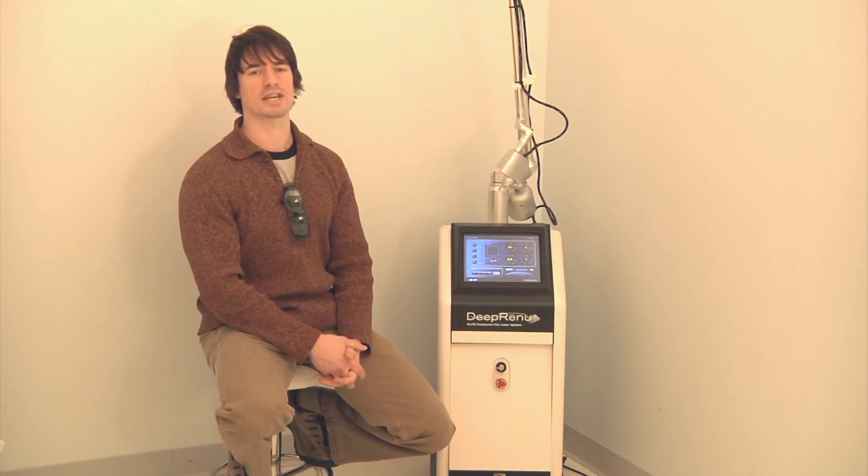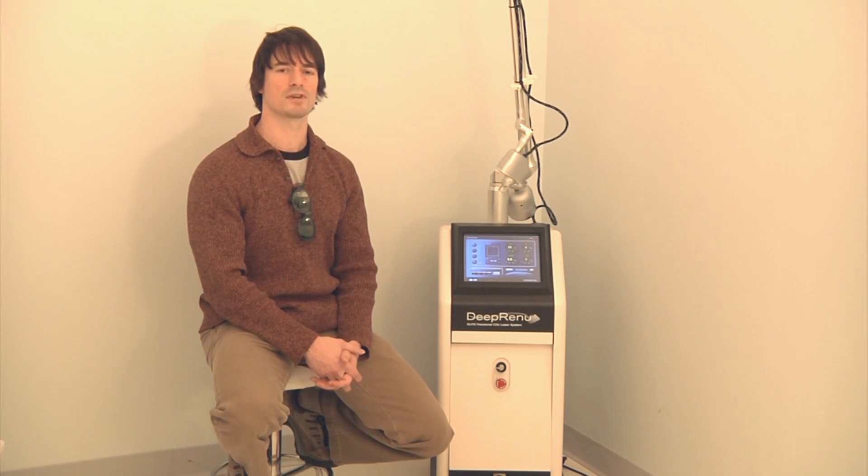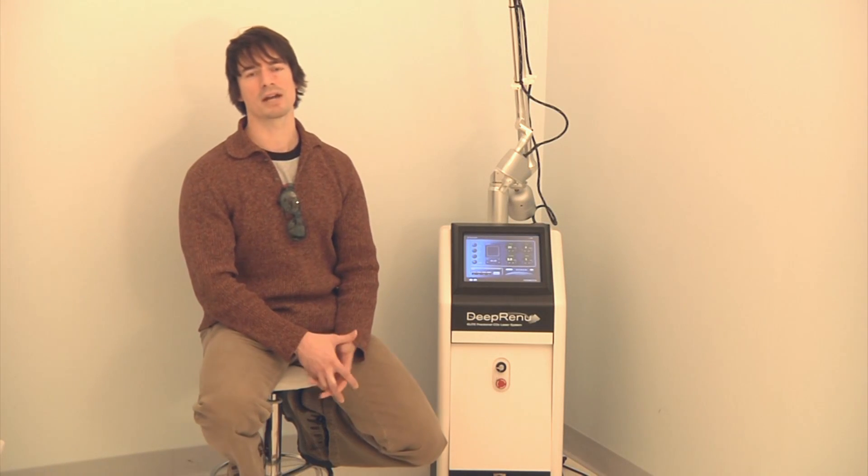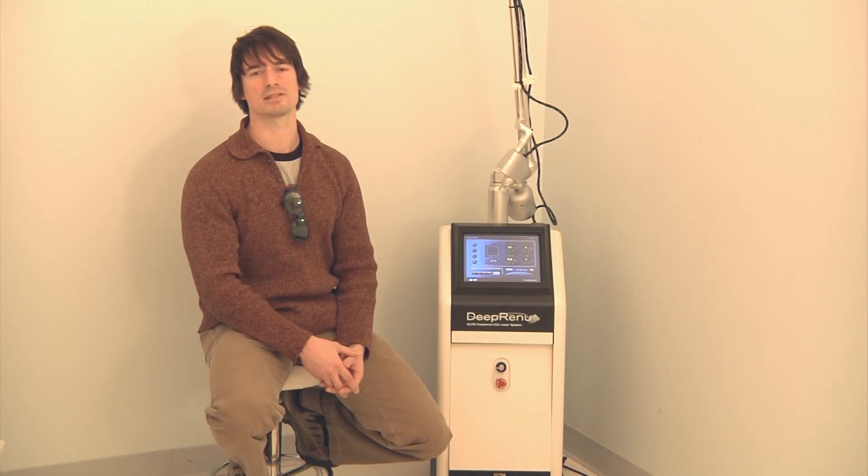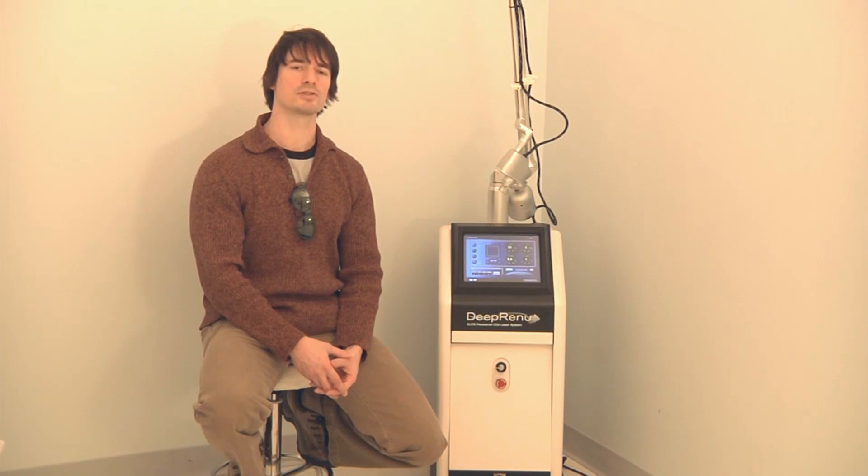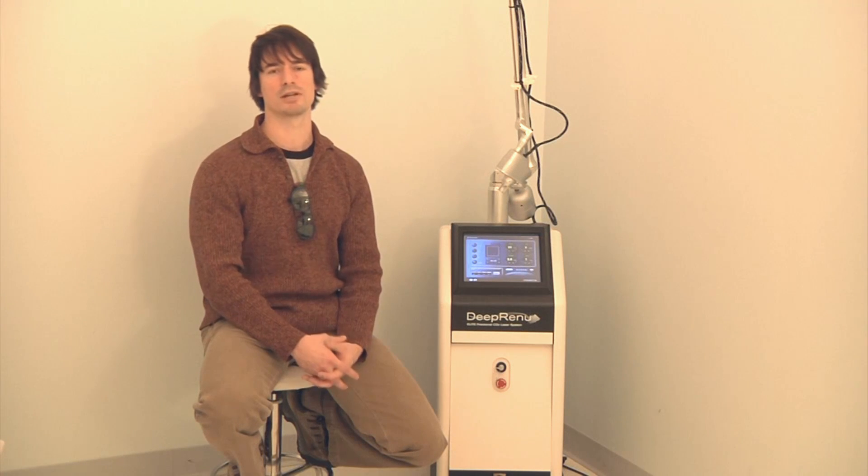In this manner, our scanner allows us to deeply treat very small wells of tissue down into the dermis, while leaving many areas of the skin intact. We can modify the density of these spots in order to target superficial pigment in the epidermis, or we can space our spots further apart in order to penetrate more deeply.